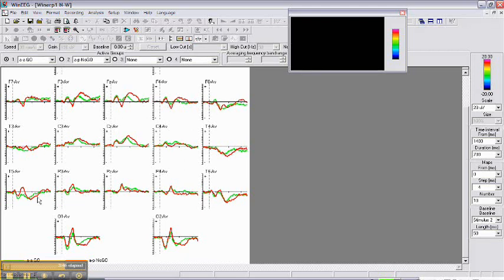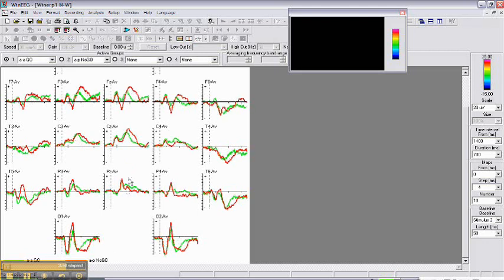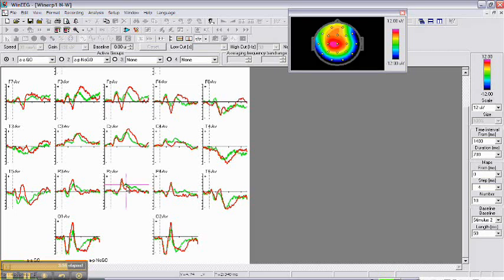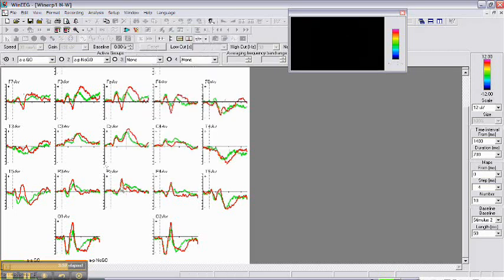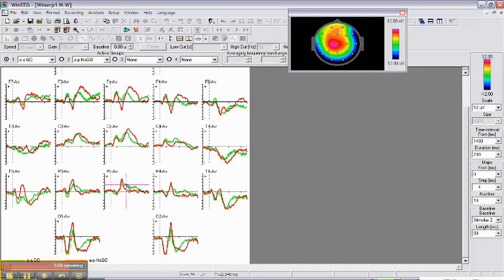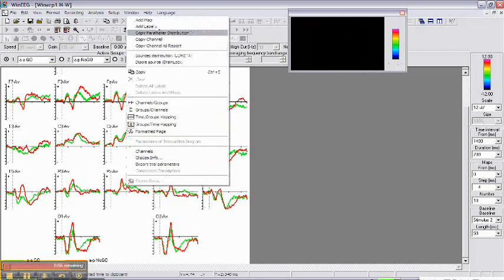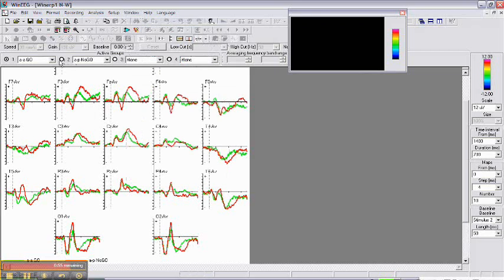Here we see the ERPs computed for go, no-go condition. Green is go condition and red is no-go condition. We can map the amplitude, the maximum of the potentials in go condition, in no-go condition.